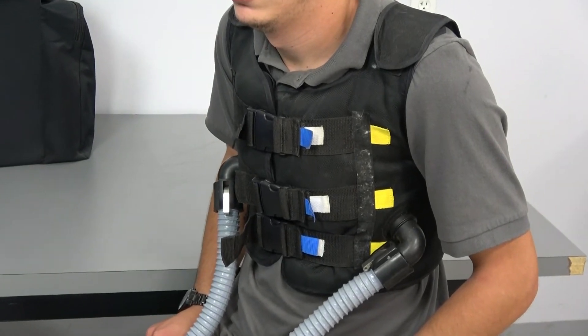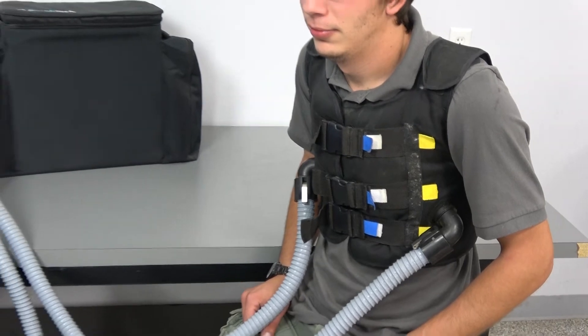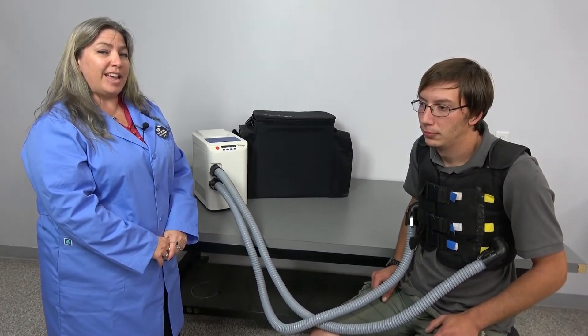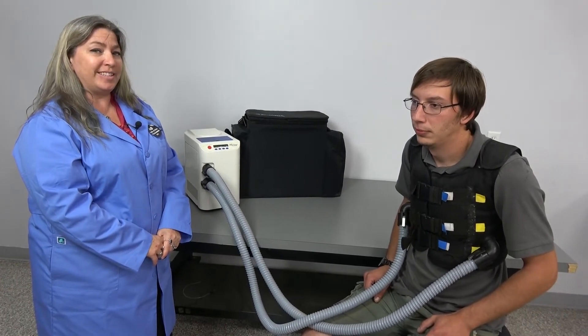This instrument has been fully tested by our in-house technicians. It is backed by our 90-day warranty and we currently have it on hand in our Cridersville, Ohio facility.